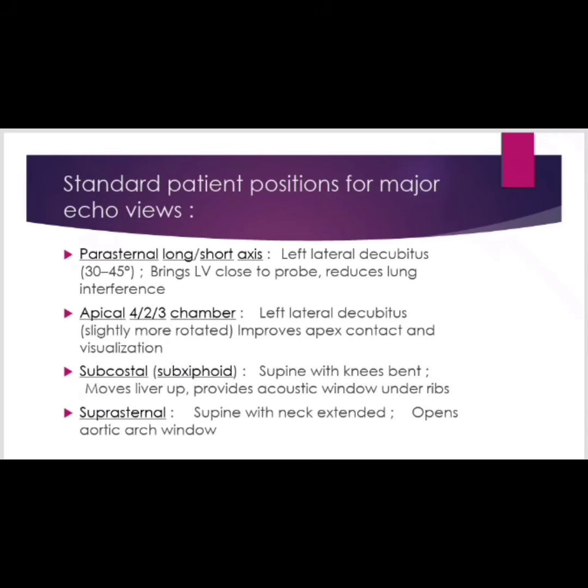Standard patient positions for major echo views. First one, parasternal long or short axis view. First, put the patient in left lateral decubitus position, which is angled 30 to 45 degrees. It brings the LV close to the probe and reduces lung interference. Next, apical 4, 2 or 3 chamber view: same position, that means left lateral decubitus, but slightly more rotated. It improves apex contact and visualization.